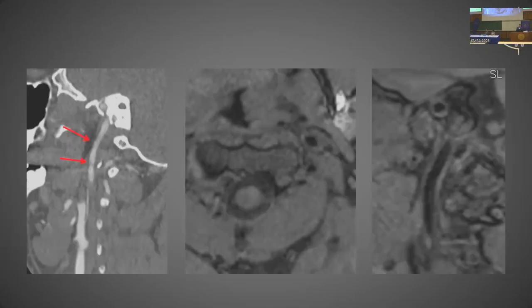And then one of the last cases I'm going to show, there's a patient who was in the setting of trauma. And then on CTA, this was interpreted as a grade 1 dissection, blunt cerebrovascular injury. And that usually buys a patient a number of days in the ICU and sequential TCDs and treatment and follow-ups and all those sorts of things. Vessel wall imaging showed the wall was completely normal, no dissection here. So that certainly saved the patient a lot of care and a lot of potential risk in terms of being hospitalized.